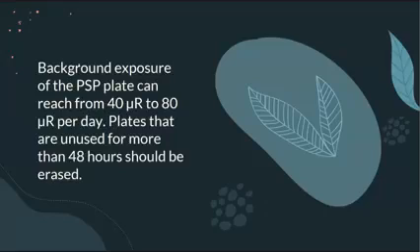Okay? So for example, pagdating mo for your shift, no, duty, before you start na mag-x-ray sa mga pasyente, you have to erase yun. Okay? The contents before you start.